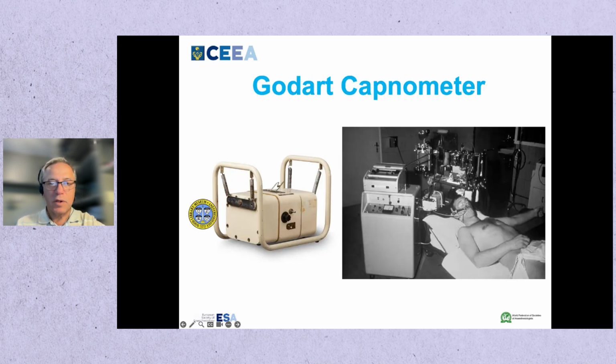Most capnographs measure CO2 via infrared CO2 detectors called Luft detectors, which were first introduced by Carl Luft in 1943. Use of this technology in medical settings began in the 1950s. Because the data from the detectors had to be amplified, calculated, and converted into signals for display and graphing, early capnographs were large multi-piece machines.